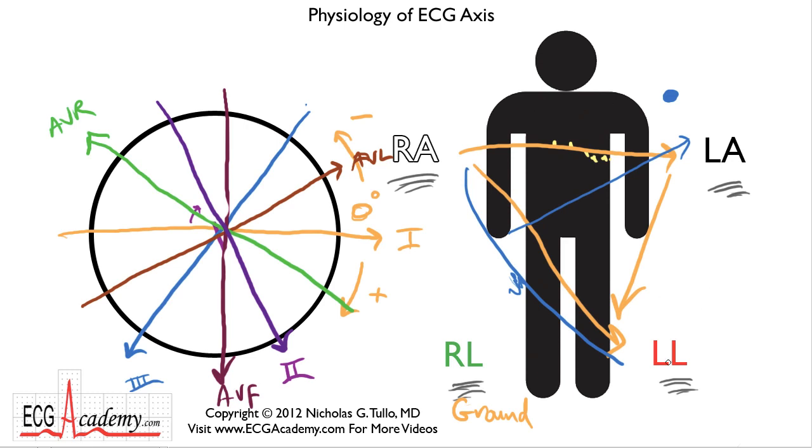Now, what does axis tell us? It basically tells us what general direction the electrical signal is traveling. So here's the heart inside the guy's chest. If the electrical signal is traveling in the proper direction, generally ventricular activation is going to be traveling down and towards the patient's left. As a matter of fact, the atrial signal starts in the high right atrium, and that will generally travel down and towards the left as well. So we usually consider this quadrant here to be the normal area for axis to be in.